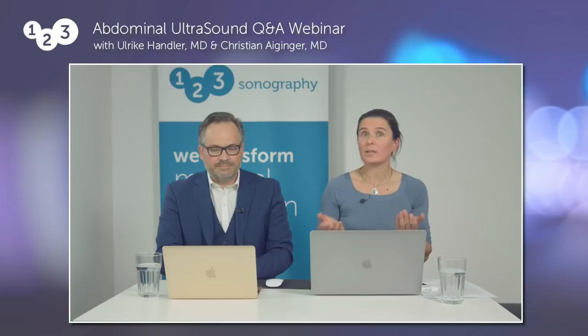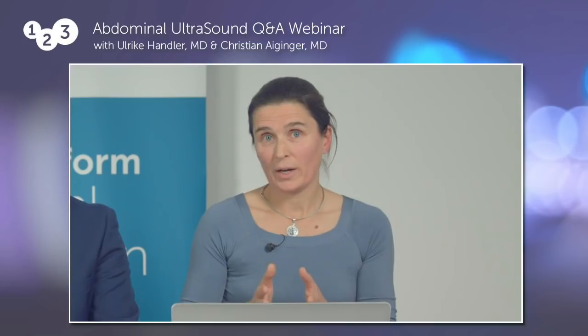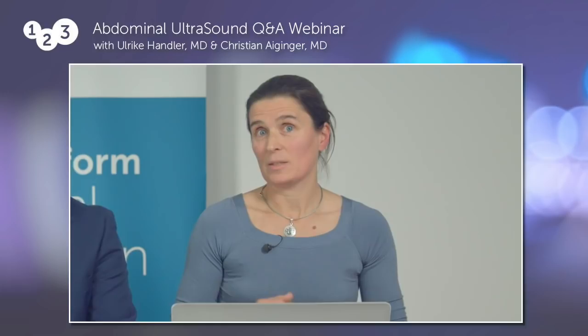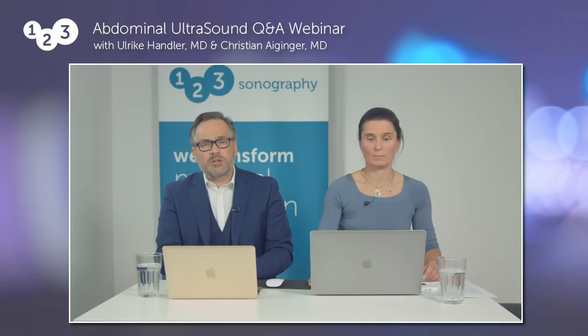Then it's a matter of rotating and tilting your transducer a little bit more caudally until you find a tubular structure without any peristalsis and less than six millimeters in diameter. We have shown this on the anatomic model and in live scanning in our online course — let's show you some scenes from this video.